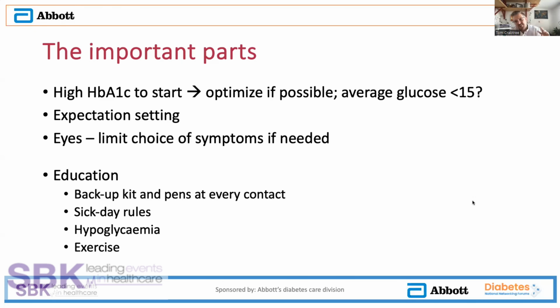And then the two other big things that are a bit different that we need to remind people of are the treatment of hypoglycemia. So often in closed loop users, they need less treatment to bring their blood glucose up. So it's important to emphasize that, because what you don't want them to do is get onto a roller coaster where they overtreat a hypo, the pump gives insulin, and drops them back down. It can be quite difficult to then get things stabilized again.